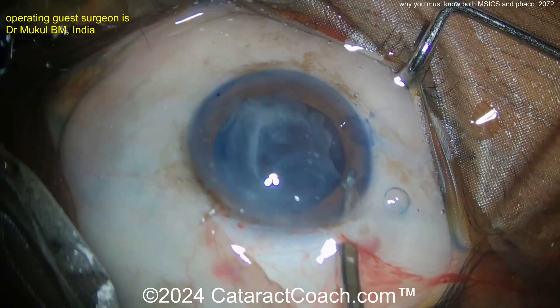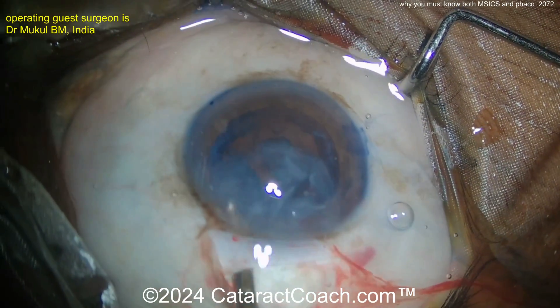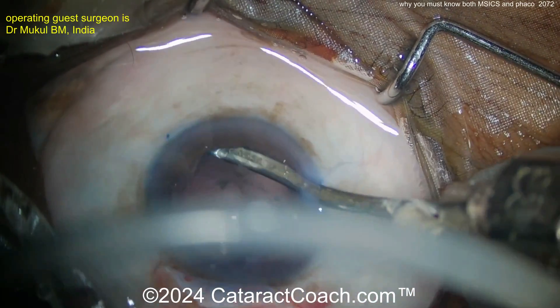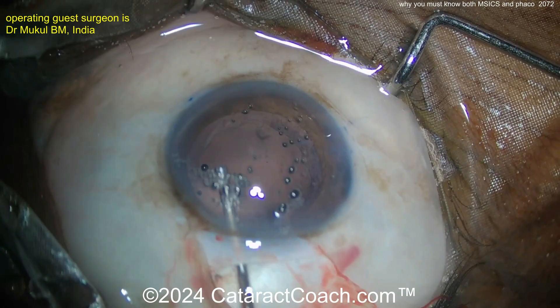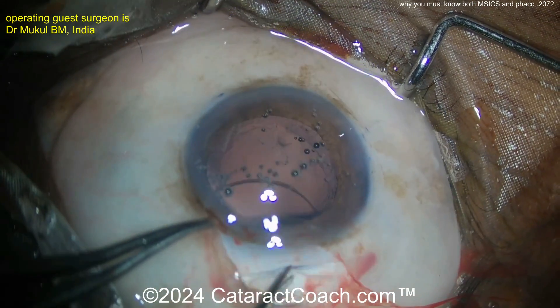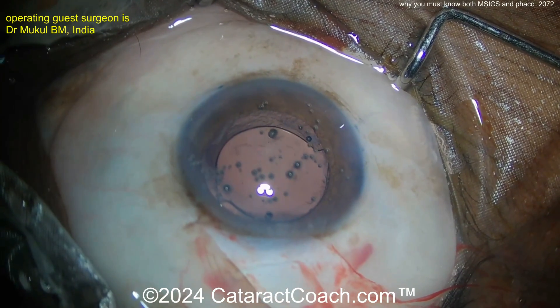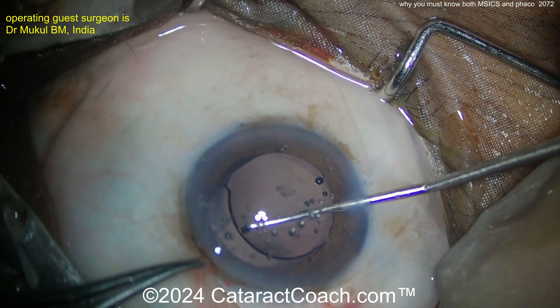A Simcoe cannula is being used to flush out the epinuclear shell. Once that epinuclear is flushed out of the incision, you can use the side port and use the Simcoe for cortex removal. Now viscoelastic fills up the eye and the capsular bag. Here's the lens — no need for a foldable lens because you have a big incision, and that lens can be placed in the capsular bag. You can see what an efficient surgery this is.